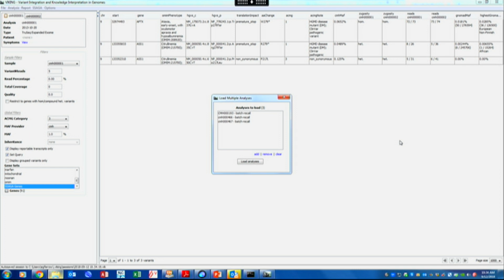So when we're doing a real case, we use SAGA. It's a different version of SAGA where we're using HPO terms instead of SNOMED terms. So it's a little bit more searchable and user-friendly. But we also use Phenomizer. So we might end up loading a few different gene lists. Some commercial labs have big panels of autism genes or whatever. Sometimes we use other people's gene lists that we find, or we make our own, or we just throw everything we can at it.